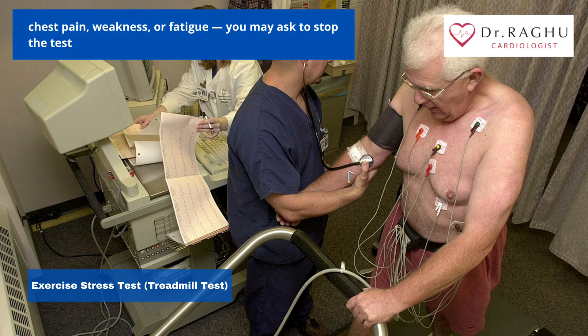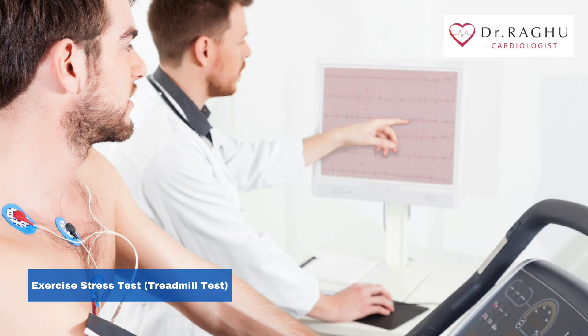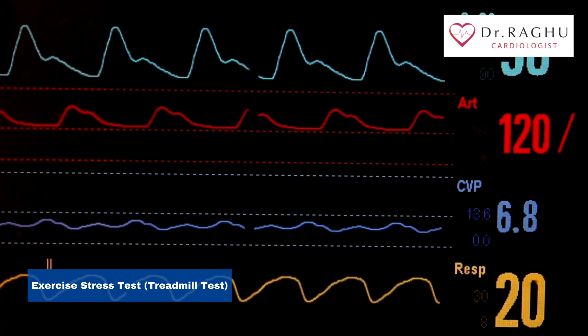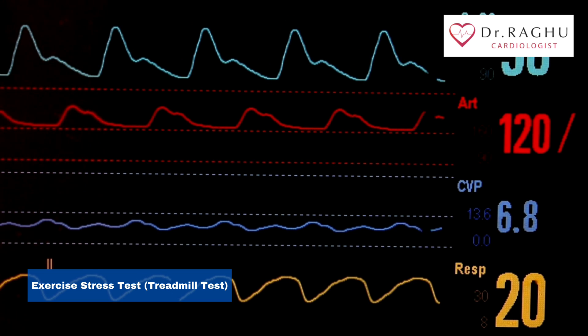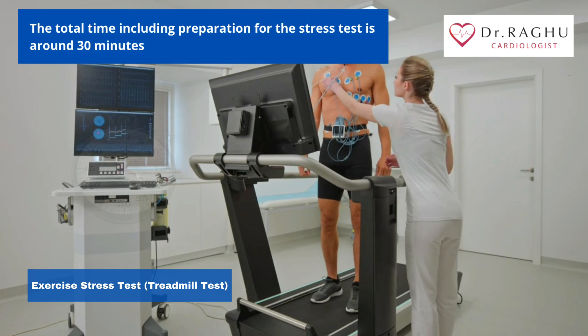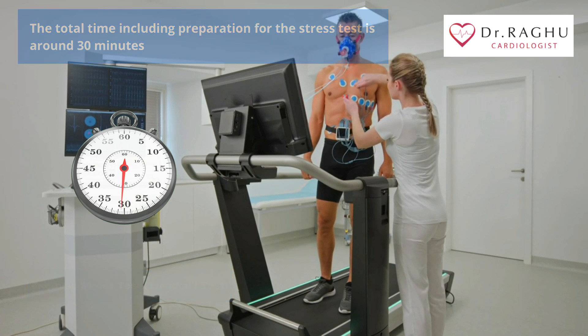If you experience any difficulties, especially chest pains, weakness, or fatigue, you may ask to stop the test. When your doctor is satisfied with your results, you'll be able to stop exercising. Your heart rate and breathing will continue to be monitored for a short while afterward. The total time including preparation for the stress test is around 30 minutes.